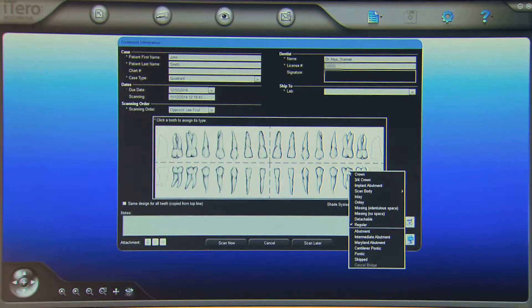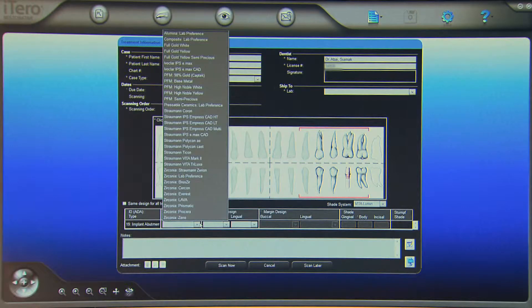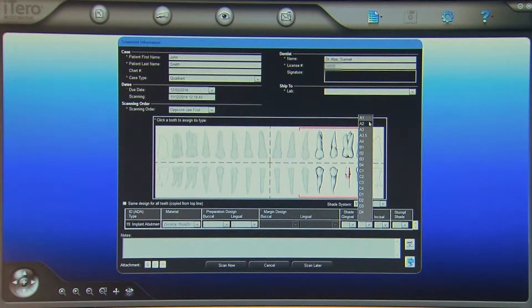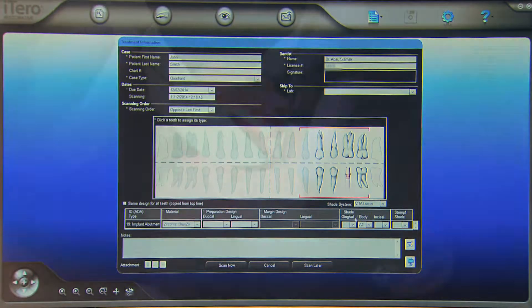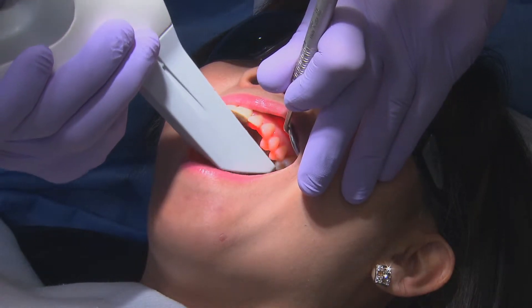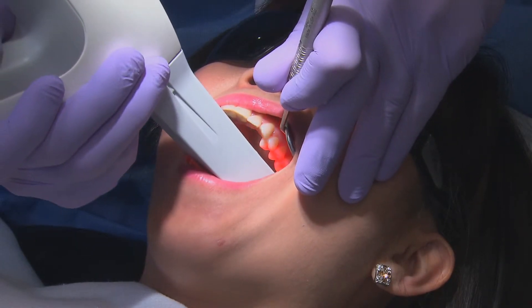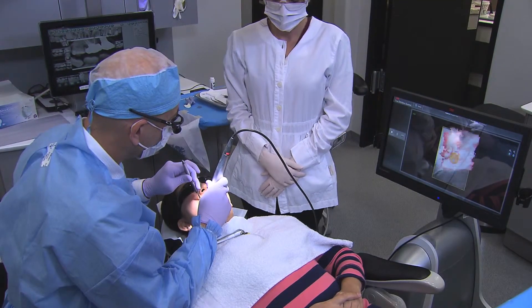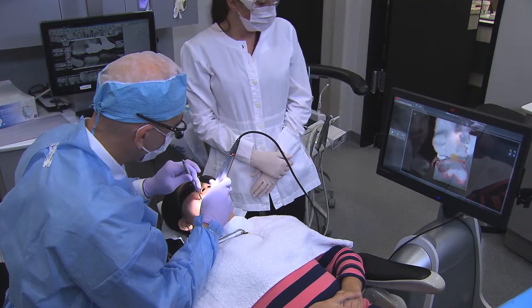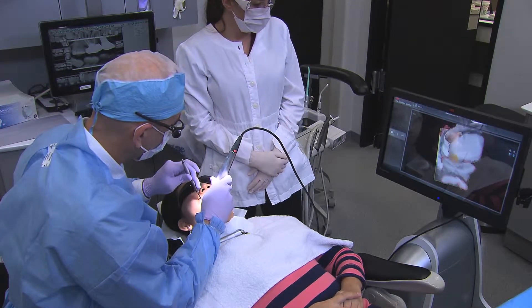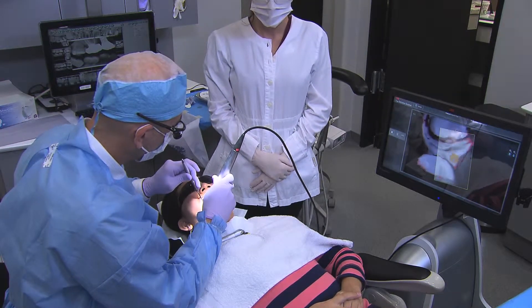It is equally important to identify the implant system, size, and desired restoration in the online RX form prior to scanning an implant case. Then the scanning abutment can be attached and the intraoral scans taken. This ensures that the information included in the received scan will transmit the implant position, depth, and angulation data, enabling the lab to produce the correct restoration.